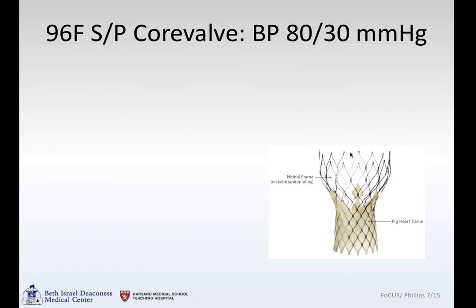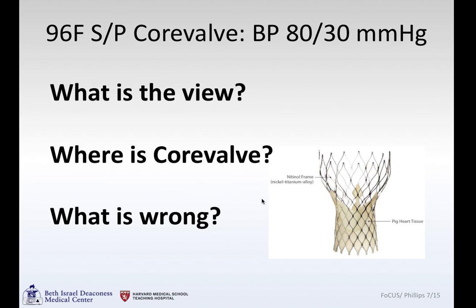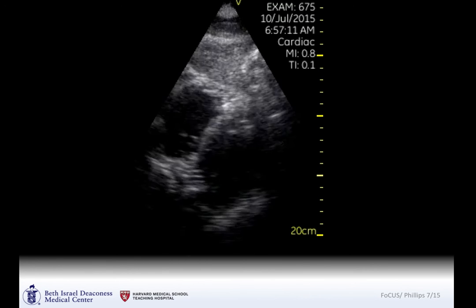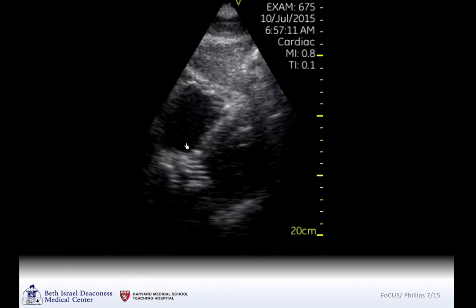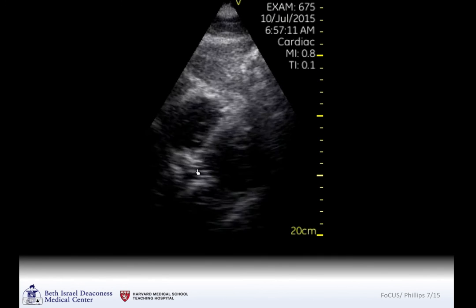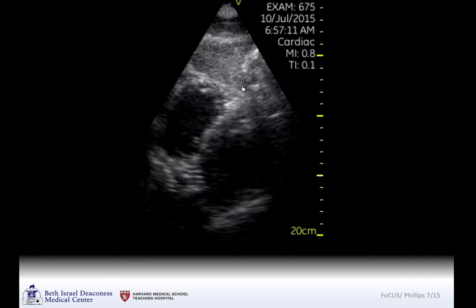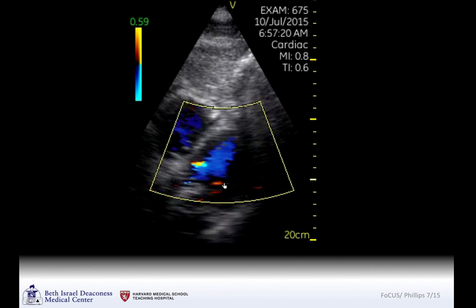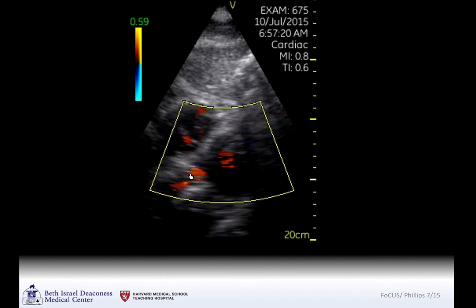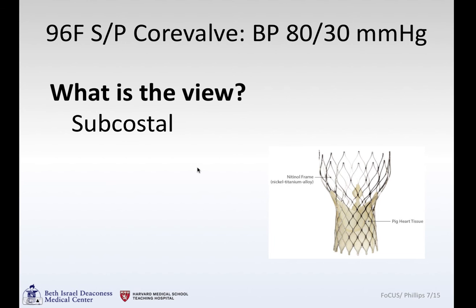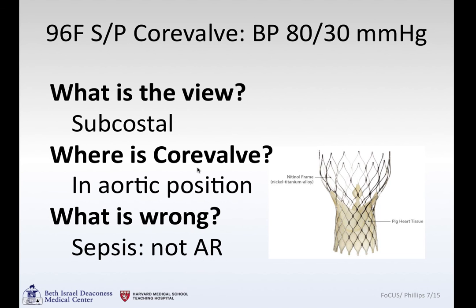A 96-year-old woman who had a CoreValve procedure a couple of days prior, now presenting with blood pressure of 80 over 30. We were called to evaluate. Subcostal view: left ventricle, right ventricle — here's the CoreValve, and it looks like it's in the right spot where the old aortic valve would have been. Here's the liver. Looking with color Doppler for aortic regurgitation — really not much; the valve looks to be working well. Turns out she ended up having sepsis, not aortic regurgitation, explaining her hypotension.